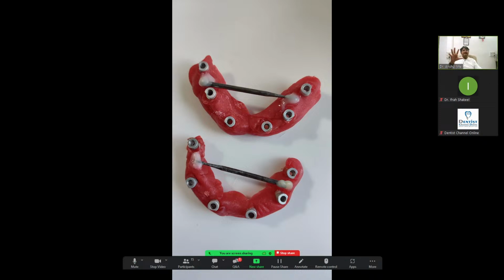So the lab has a denture base with the scan body inside it. What the lab people will do is place the analog on the back side, flow gum silicone, and pour the cast. They will get the complete tissue surface from the back side, and from the top side they will get the scan body. So that's what we commonly do.